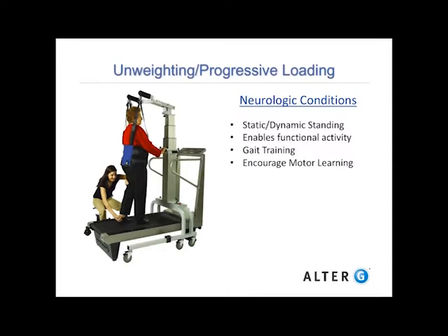And then encourage motor learning. So with harnesses over treadmills, you can do a lot of repetition of a task-specific skill, walking. So patients hopefully will learn this and develop the ability to carry over what they're getting to over ground walking.